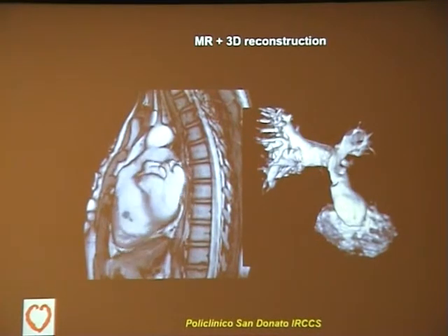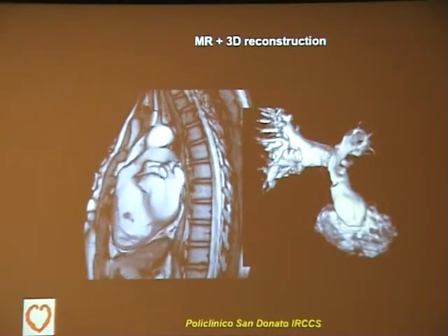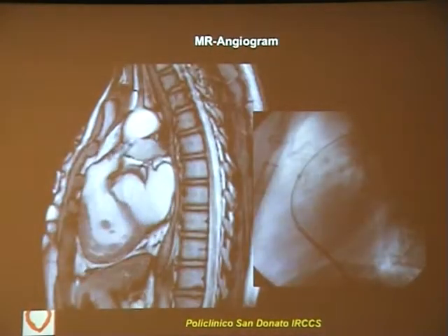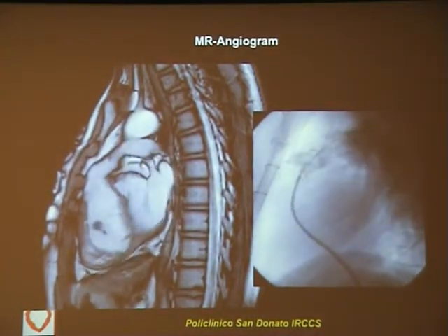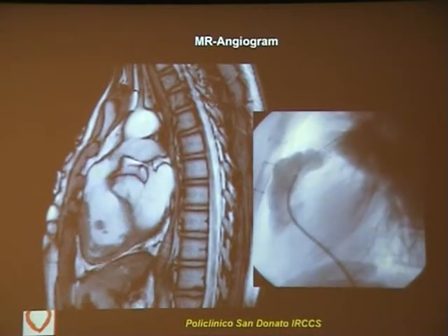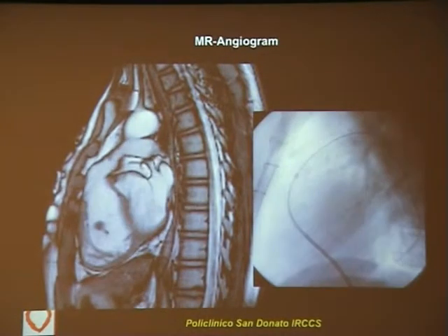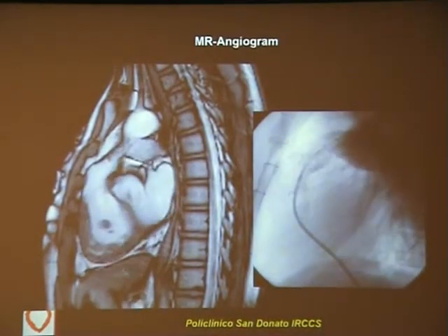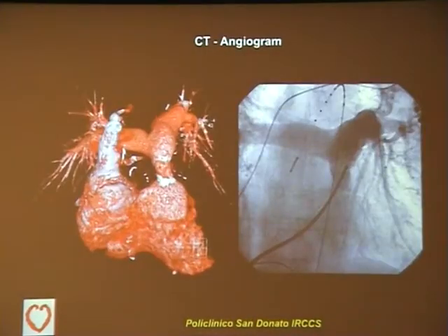So the MRI is the key imaging tool for assessing the anatomy and the physiology of the right ventricle. This is an example of a stenotic and mildly regurgitant conduit with a corresponding 3D reconstruction, which is very useful to get an idea about the morphology of the outflow tract. And it is also important in the cath lab to obtain pictures that are matching the pre-procedural assessment by non-invasive tools. And you can appreciate in this angiogram the stenosis of the conduit, but also the calcification around the conduit.